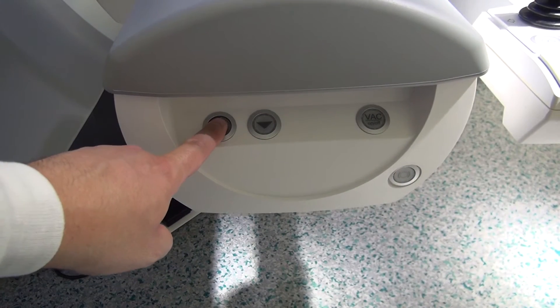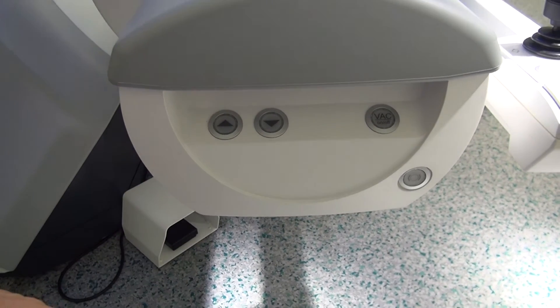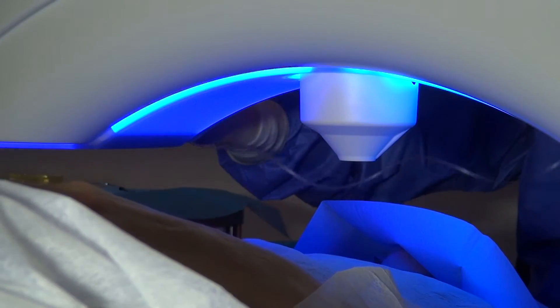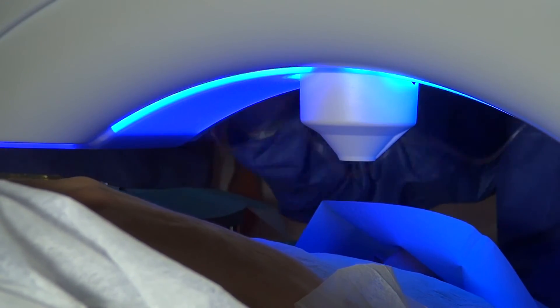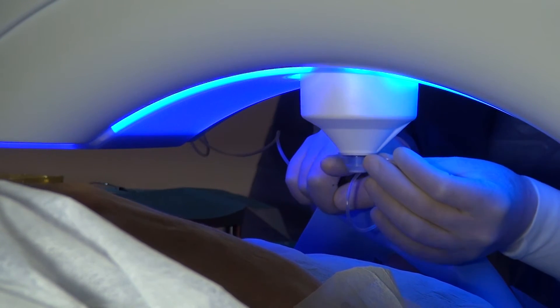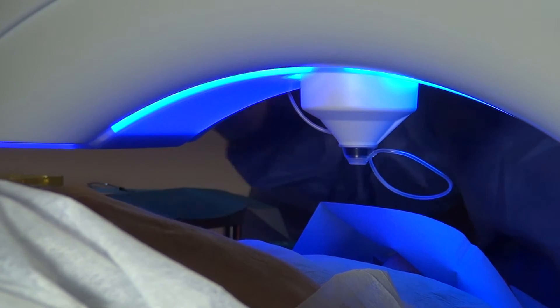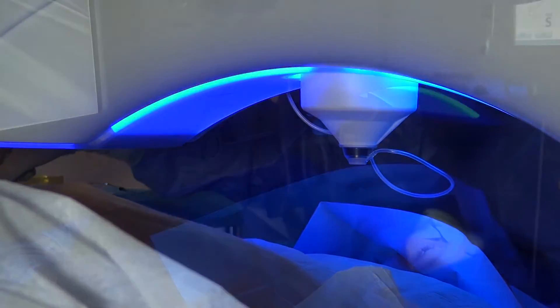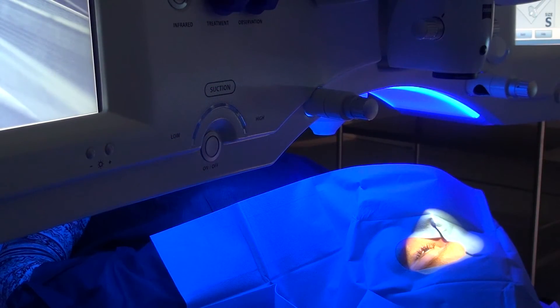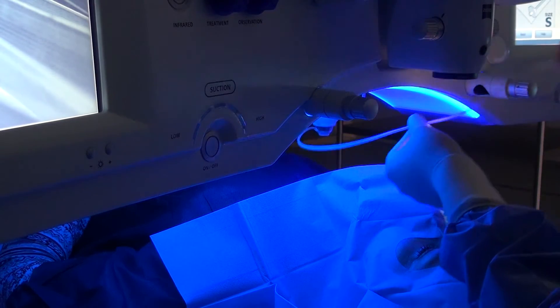To do that, move the headrest up and down. The treatment objective that holds the contact glass is quite bulky. In some cases, it can come into contact with the patient's nose, preventing proper alignment of the eye with the contact glass. In most cases, it is better to turn the patient's head slightly away from the treatment objective.